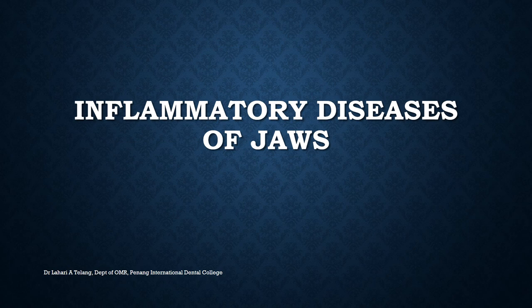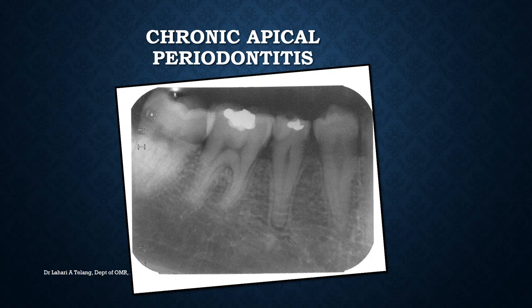Looking at inflammatory diseases of the jaws — first, chronic apical periodontitis. It appears as widening of the periodontal ligament space, generally seen in a tooth with pulp involvement due to caries, fracture, or trauma from occlusion. You can see widening of the periodontal space in the apical area and thickening of the lamina dura around the apical region of the tooth.